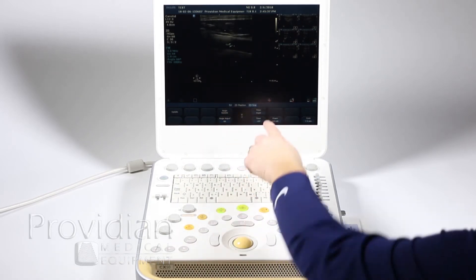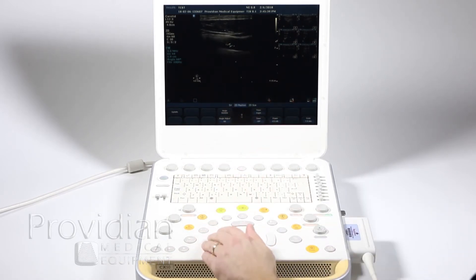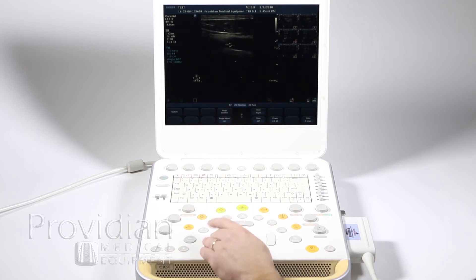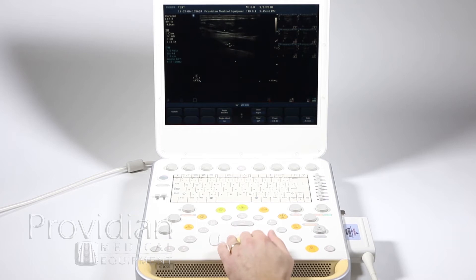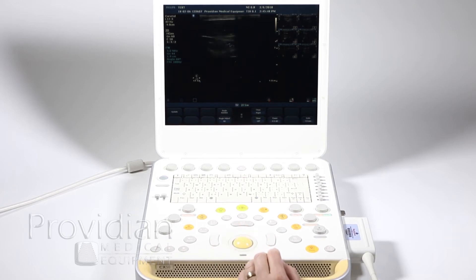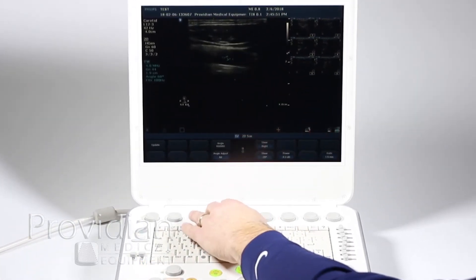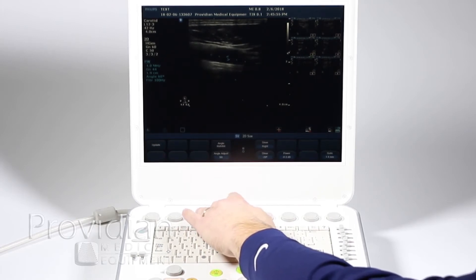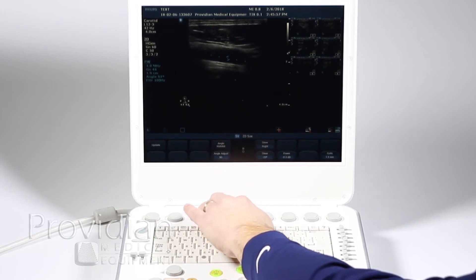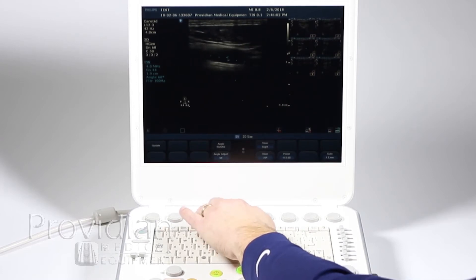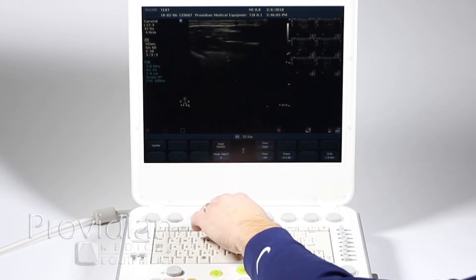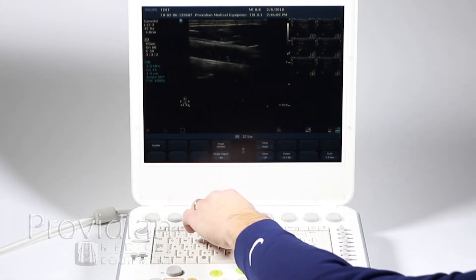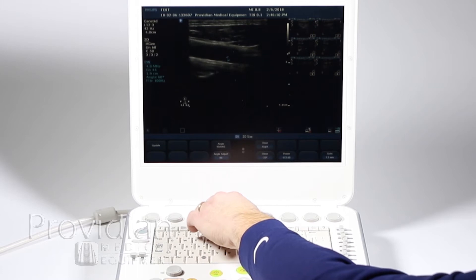Here's sample volume. And if I click 2D size or 2D position, that's going to do the same thing as it did before. My angle adjusts, which will twist it down here. If I press, it does the quick angle, and there is a blue line that shows my quick angle along with the direction of the blood flow.